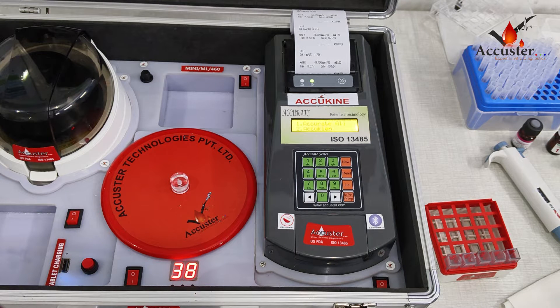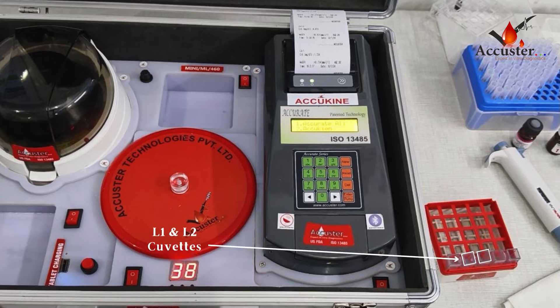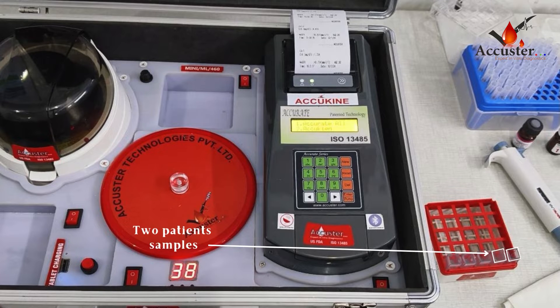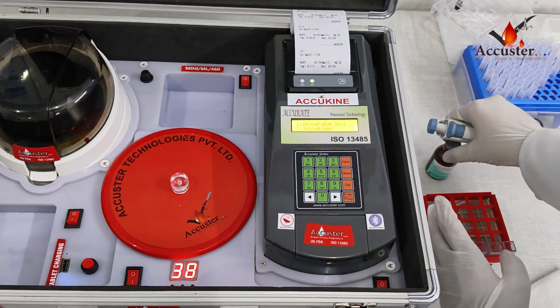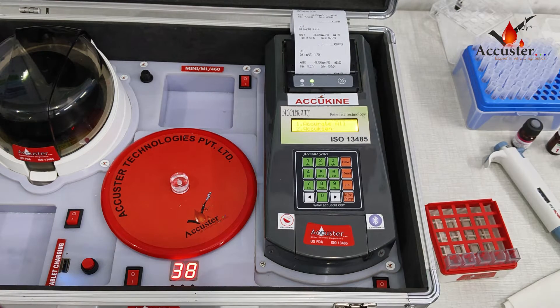The test is kinetic, so calibration is not required. Take 5 clean Q-Vets: 1 Q-Vet for distilled water, 2nd for L1 and L2, and 2 for patient samples. Add 500 microliters of reagent in each Q-Vet.